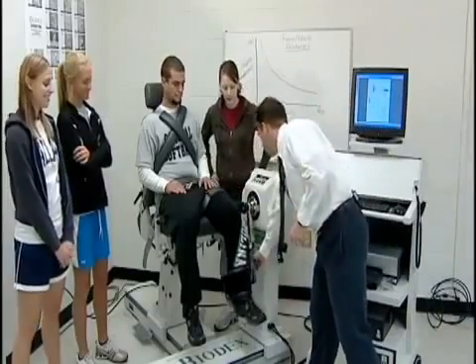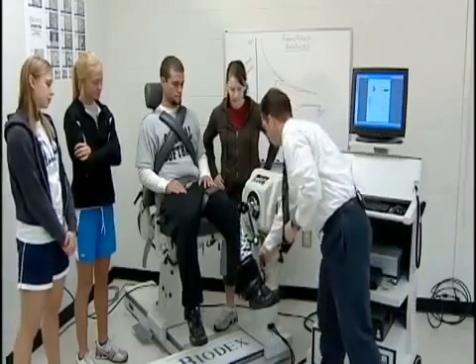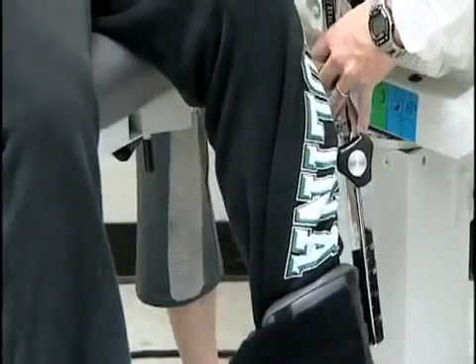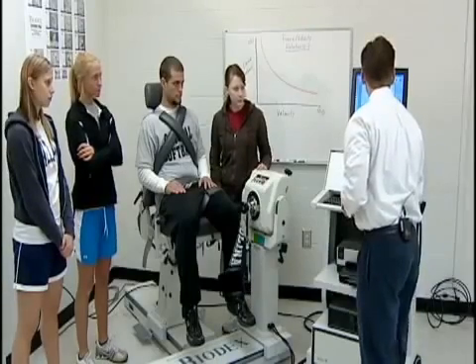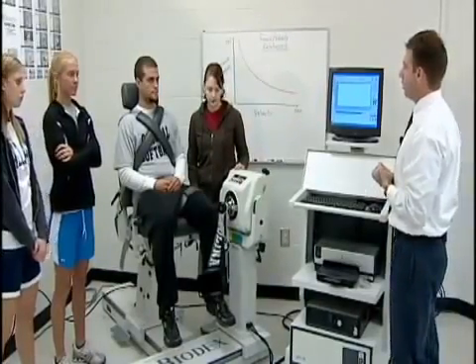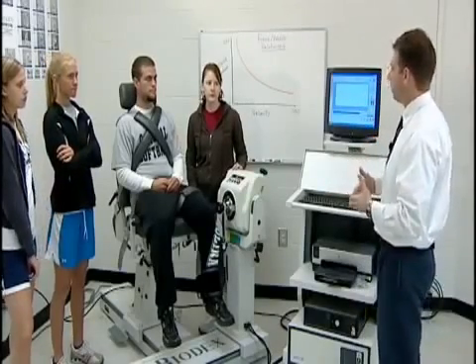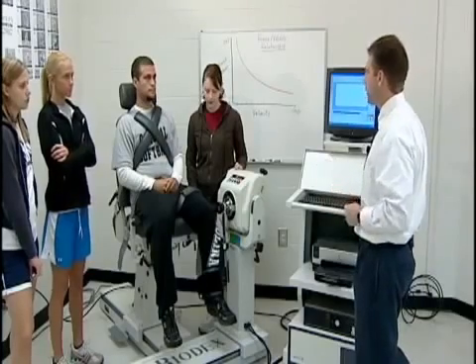The first thing we're going to do is set his range of motion. We're also going to test at multiple speeds — very fast and very slow. As we've discussed with the force-velocity relationship, at a very slow speed we would expect force production to be relatively high. As we increase the speed of the movement, there's less time to recruit motor units and muscle fibers, so force production will gradually drop off the faster we go.